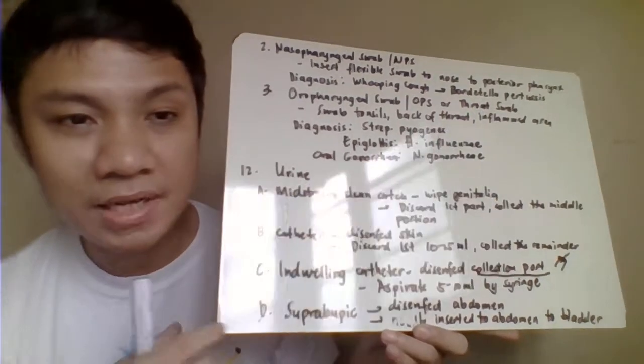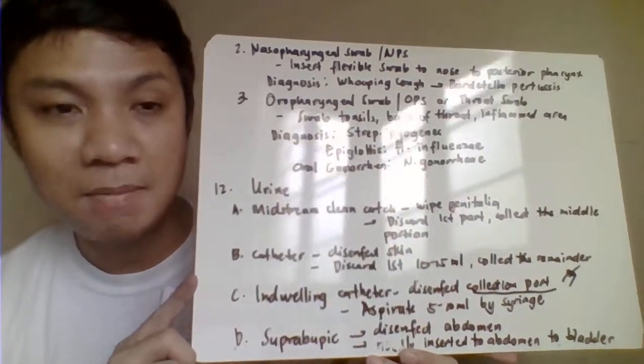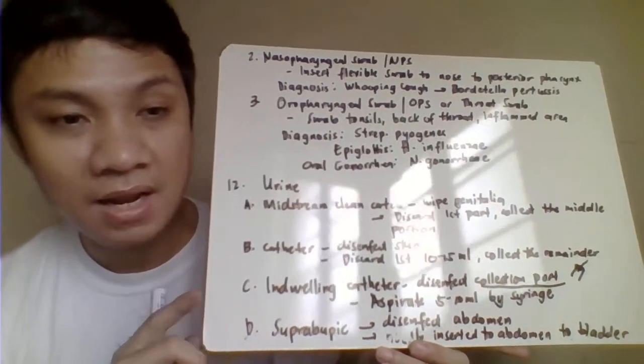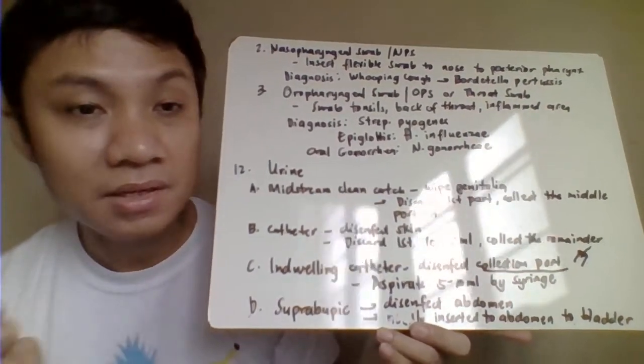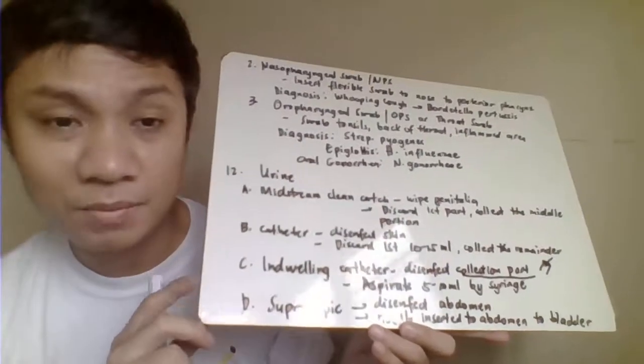And pag aspiration kasi, it will be less contaminated by your external microorganisms found in the skin, just like your midstream clean catch or random na mga urine sample.